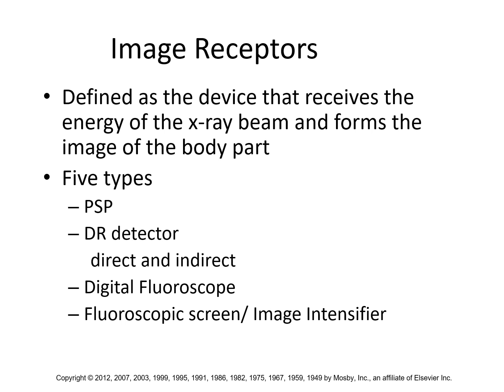Your digital fluoroscope is basically the same technology as a DR detector, but it's got more robust processing electronics, and so it can do frame rates greater than 30 frames per second. Fooling, again, if you play video games, you understand that number. That's the threshold that fools a human eye into thinking that it's fluid motion picture, when it's actually just individual still pictures, but you push them past the human eye so rapidly, 30 pictures a second or greater, and it looks like motion picture. It looks like fluid motion. Okay.